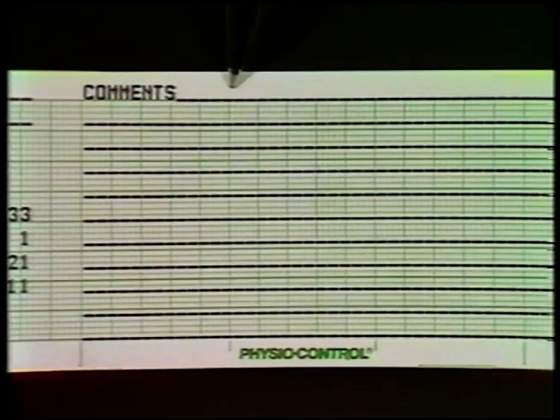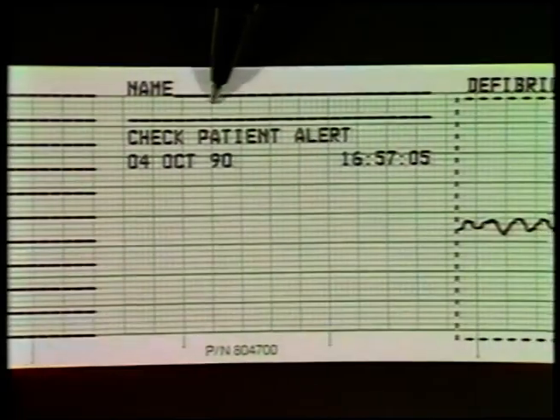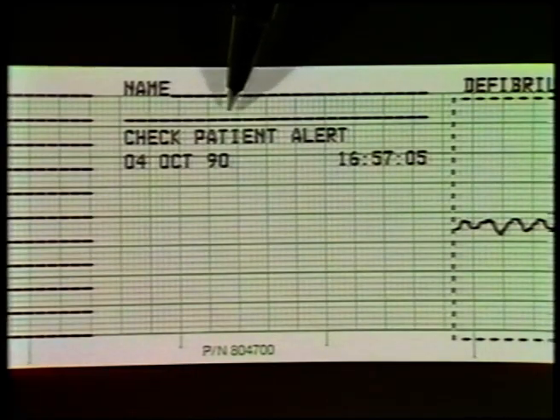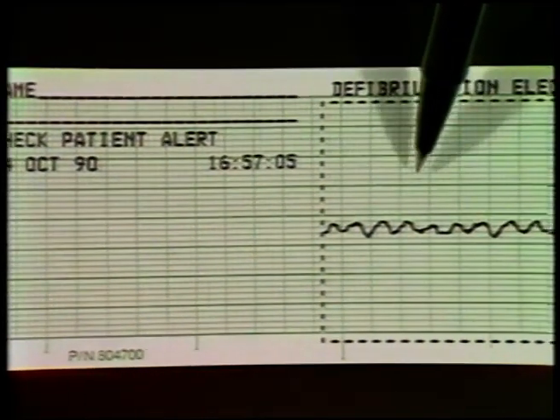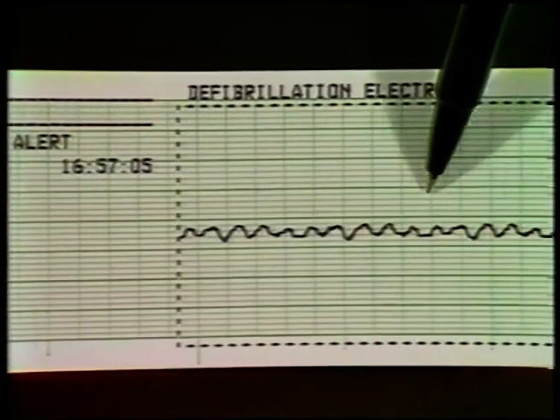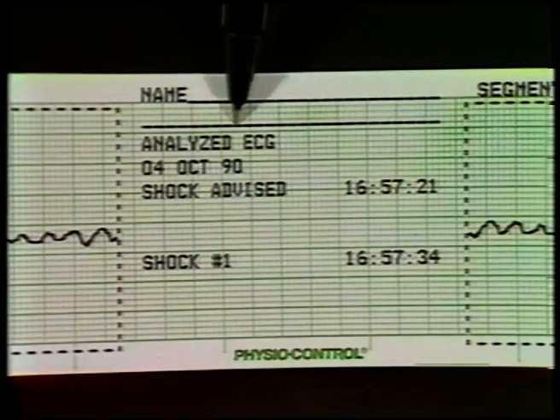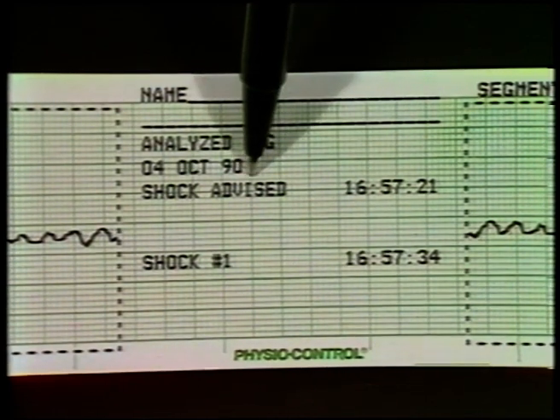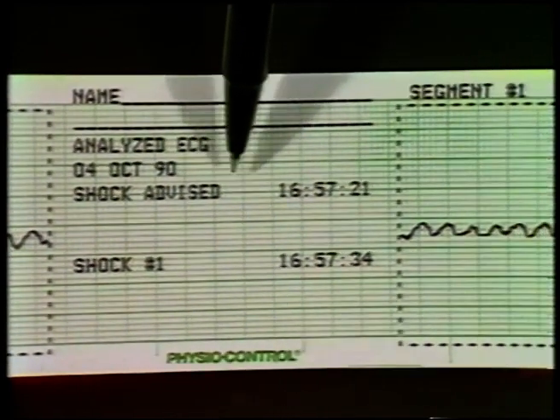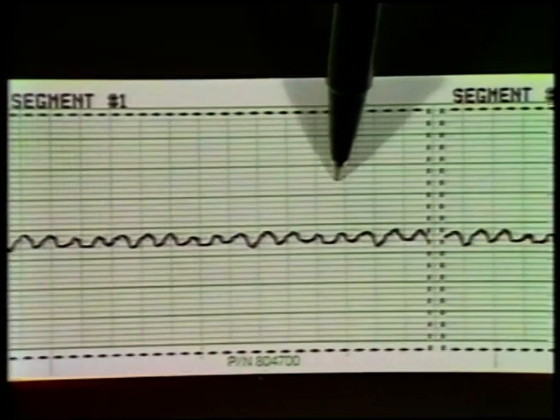Following the comment section is a chronological listing of all the stored critical events. For example, this is the check patient alert format. With each check patient alarm, the LIFEPAK 300 records the date, time, and 6 seconds of patient ECG. This is the shock advisory format. With every patient ECG analysis, the LIFEPAK 300 notes the time and date of the analysis and the shock or no shock recommendation. Following this information is the ECG tracing the LIFEPAK 300 used to make its recommendation.